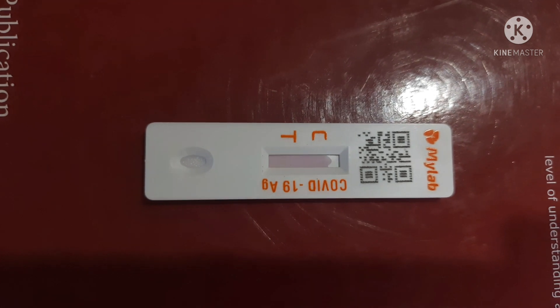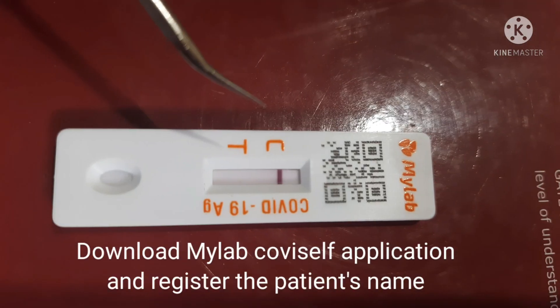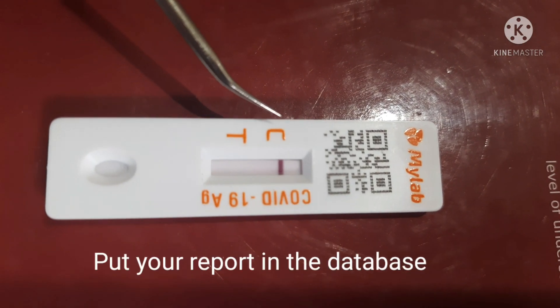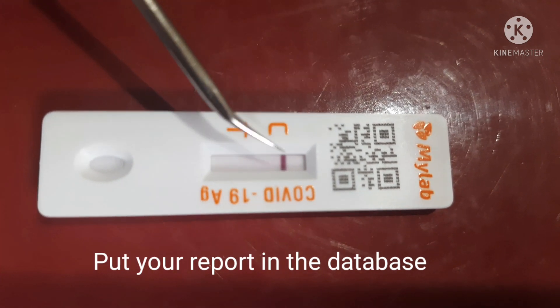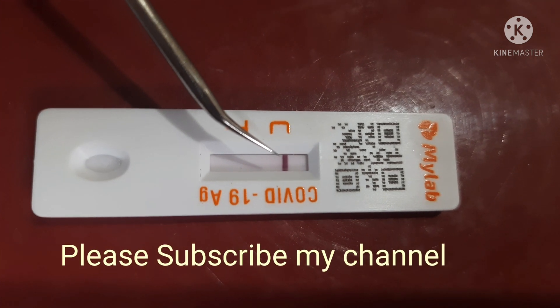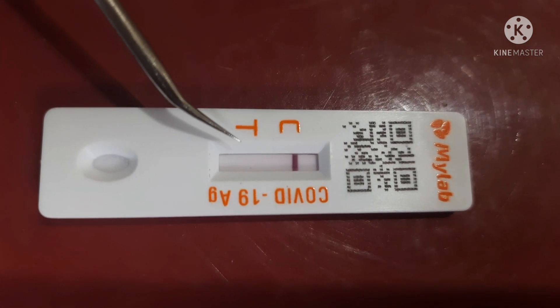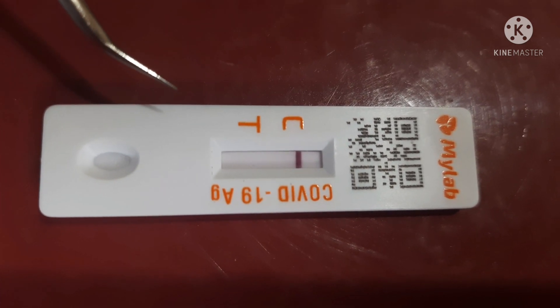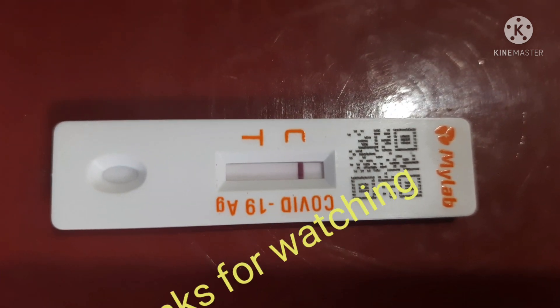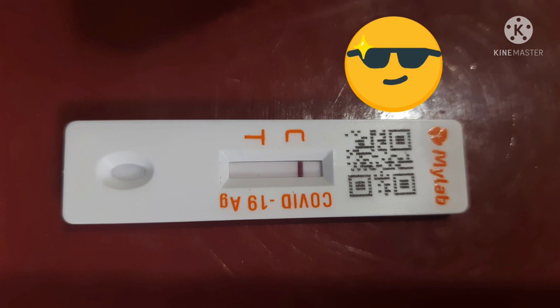You can see two different markings beside this panel: one is C and another is T. C stands for control mark and T stands for test mark. If one band appears beside the C mark, the test result is negative. If two bands appear — both C and T — the result is positive. Ongkorn, you are negative.